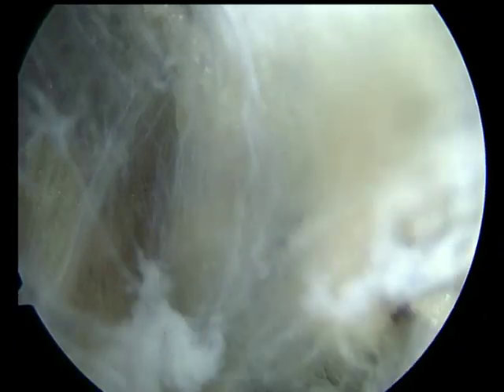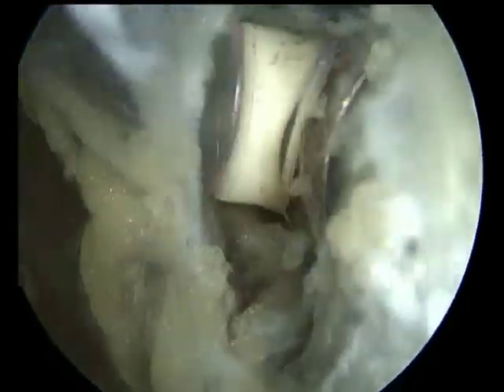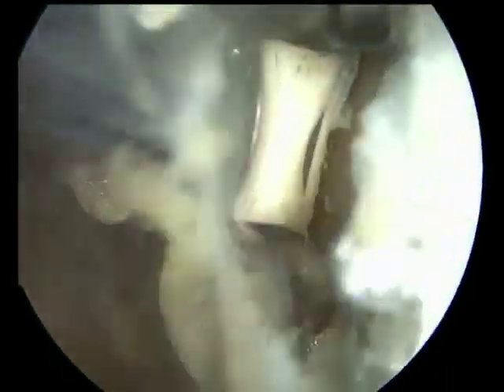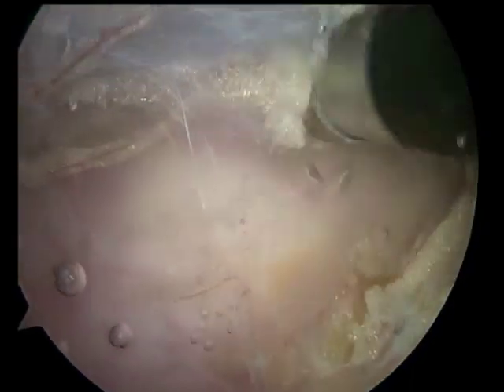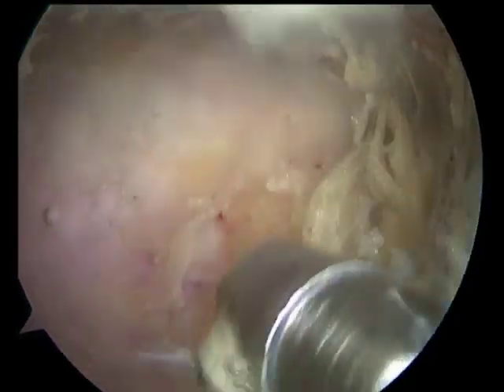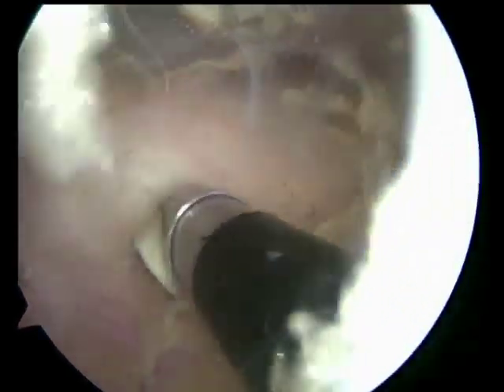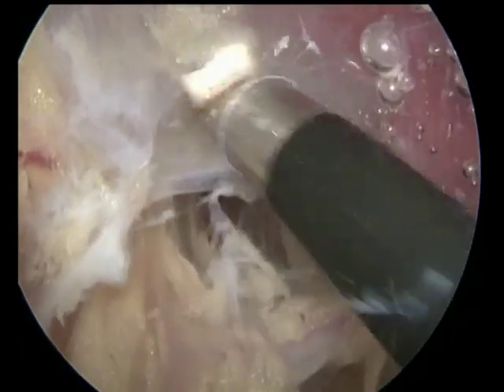Hello, let us introduce you the technique of deep gluteal syndrome endoscopic treatment with three portals technique. The first step, we introduce the medial portal where we put the camera. Then we introduce the median portal where we put the instrument, ablator, and we make a release at the area of ischial tuberosity. We clear adhesions and scars at this area.